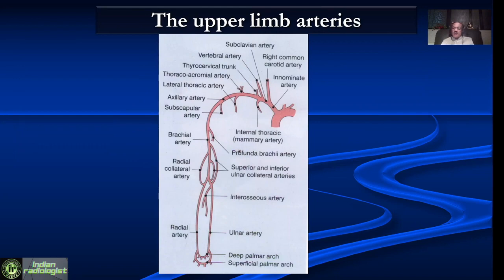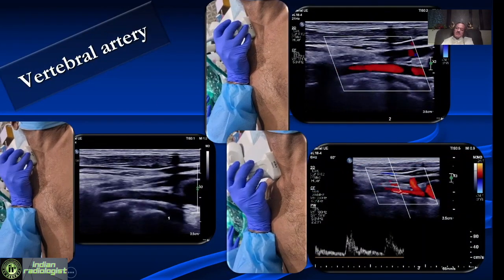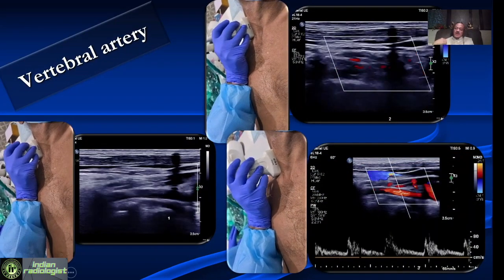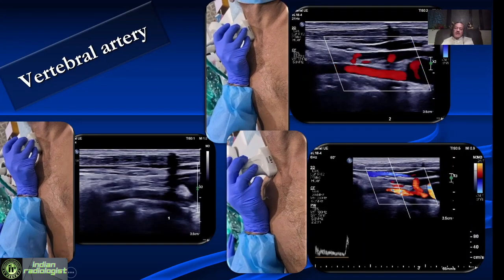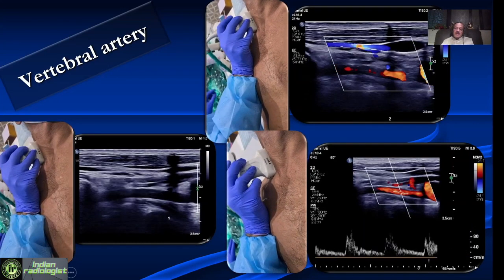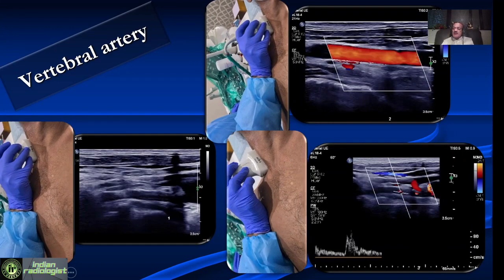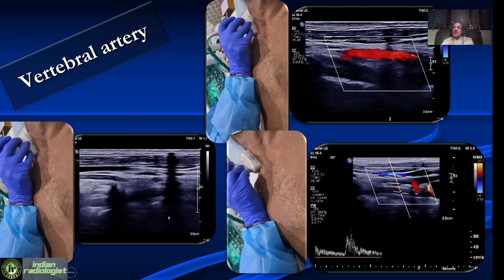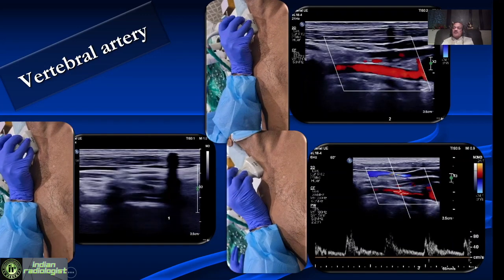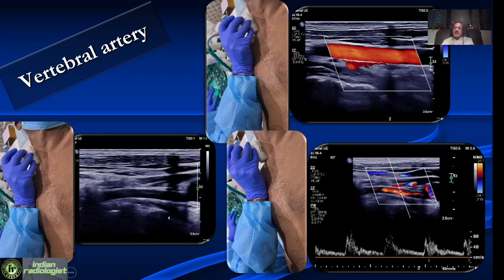You have to be very familiar with anatomy, just like any other examination. We always begin with the vertebral artery — we ask the patient to lie supine, extend the neck on the pillow, and then evaluate the vertebral artery along its entire extent in grayscale, on color, and in pulsed Doppler. On color, make sure that the direction of flow in the carotid artery and the direction of flow in the vertebral artery are the same. This is very important to pick up subclavian steal.